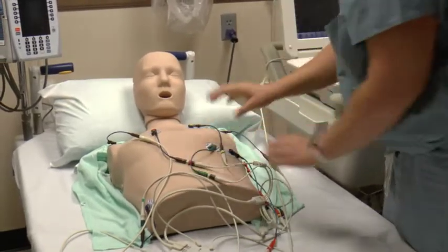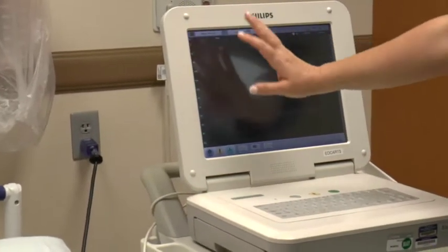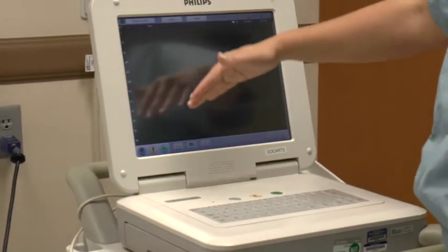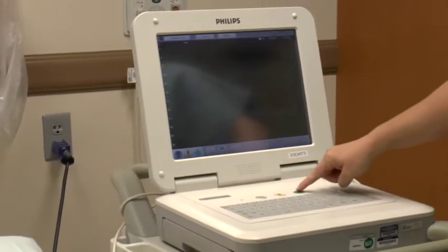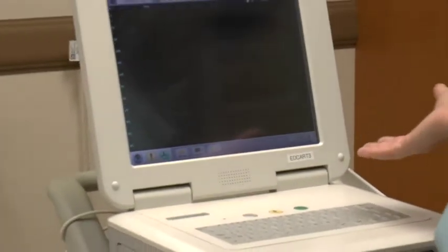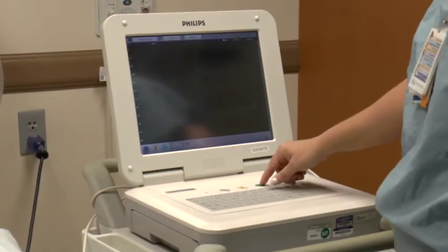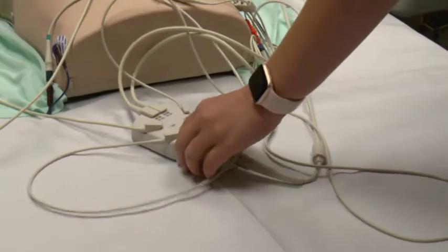Once you have all of them connected you will have an EKG tracing showing across the screen. This is a mannequin so we don't have a real tracing, but the goal is a nice, even baseline — you don't want it wandering. When the machine is happy with the tracing it will turn green, and the ECG button will light up green. That's a good acknowledgement that now's a good time to take a picture. Whenever you feel you're getting the best picture possible, click the ECG button here on the portable monitor and it will take a couple of seconds to capture.